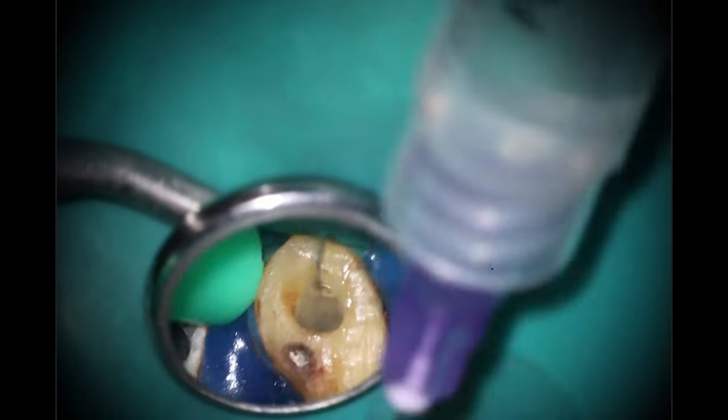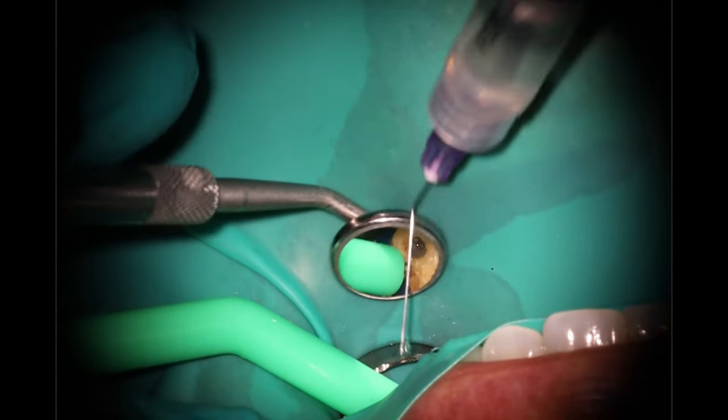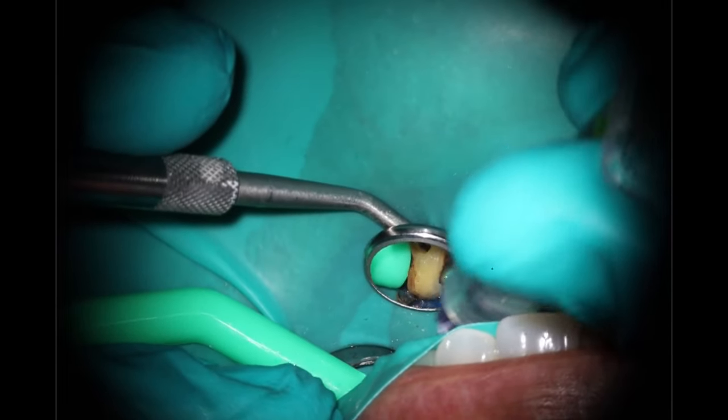One thing to remember: K files and C files compact debris — you have to rinse after these. If you're a dental student watching this, rinse after every single time. When you use rotary instruments on the other hand, they pull debris up — that's the beautiful thing about rotary instruments. So just a reminder: K files will pack the debris down inside there. You want to go back in and rinse after every file or every few files. You can use bleach. EDTA is a really effective one as well because it's a chelator and will help break down some calcification.